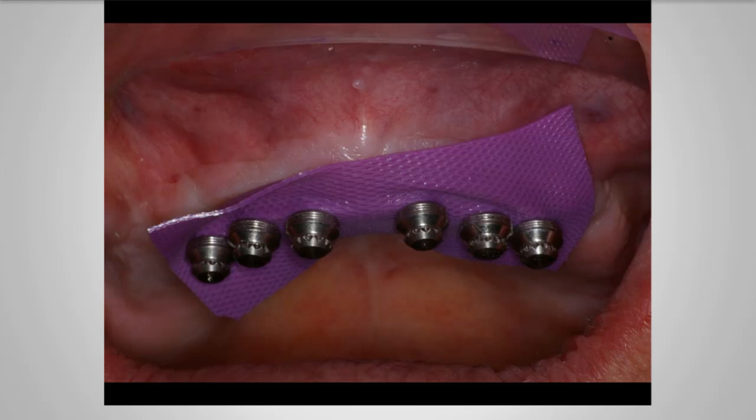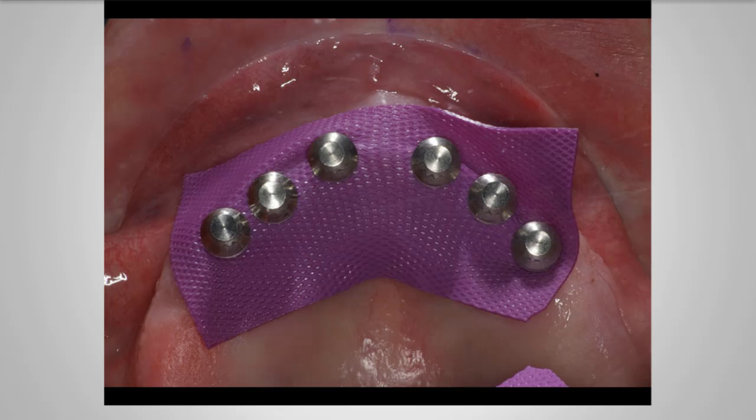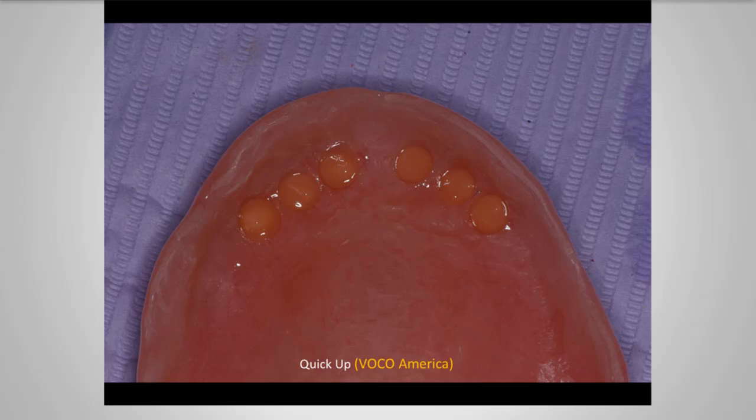We went ahead and relieved the internal aspect of his denture. Using a rubber dam, we blocked out any undercuts and snapped on the metal housings. What I will do then is trim the excess of the rubber dam so that there's not any excess in the pickup impression or hard pickup. So we'll go ahead and trim any of the excess.